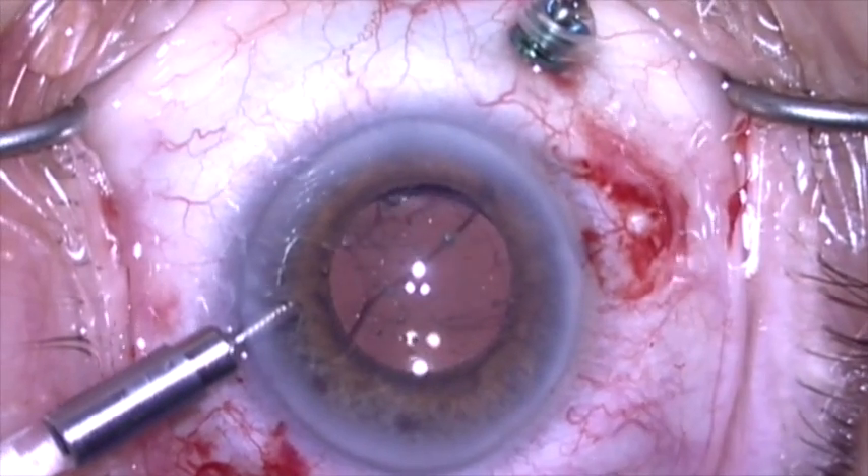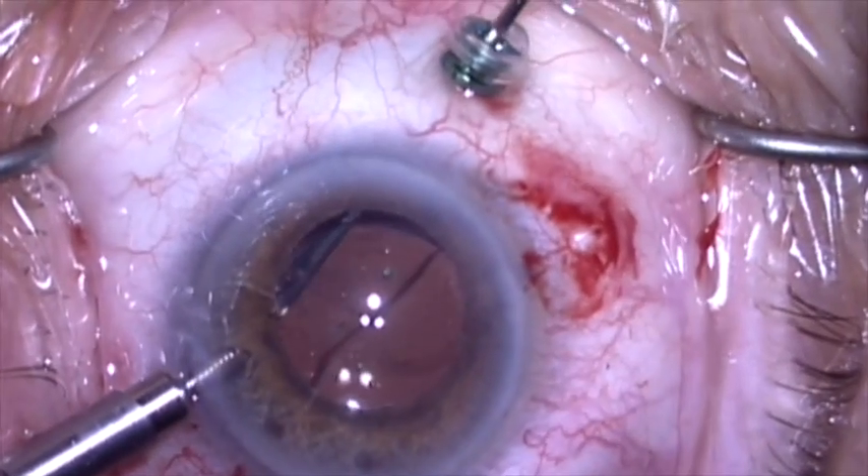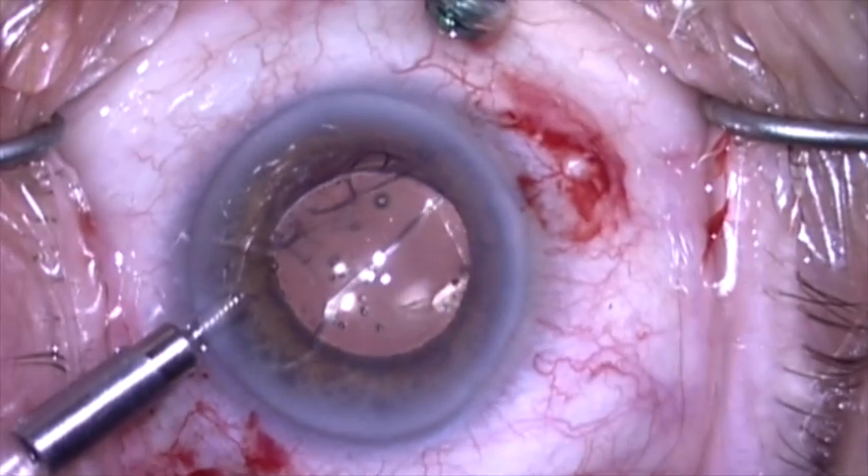Here I'm placing an anterior chamber infusion line and doing a pars plana vitrectomy, starting in the region where I saw the vitreous herniating.